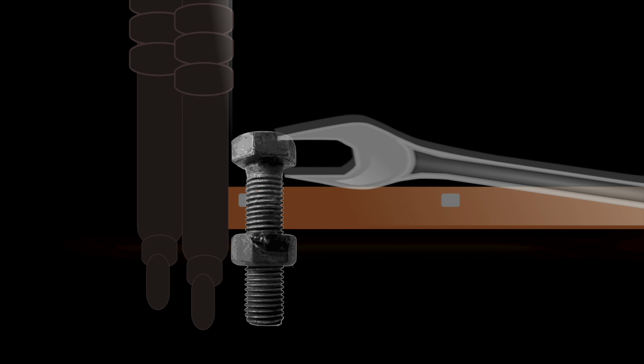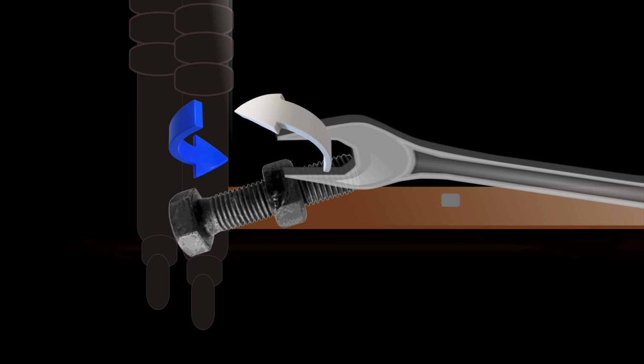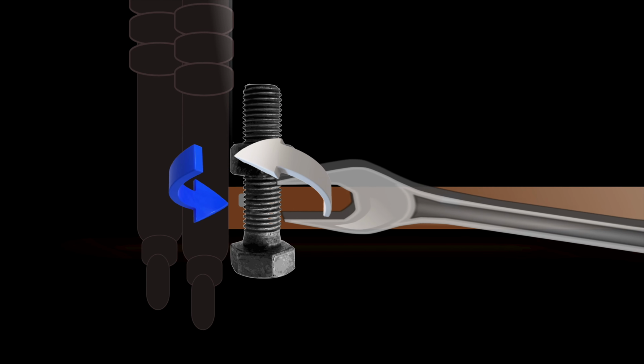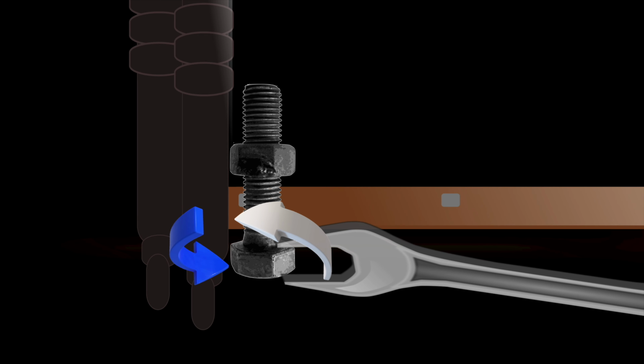So you get your wrench and rotate it in this direction to tighten the bolt. But suddenly you realize you screwed up. Welcome to the IKEA Self-Assembly Club. You realize the bolt is oriented the wrong way. It in fact needs to be inserted from the bottom. And as most of you have found out the hard way, now staring down at the bottom of this bolt, you cannot just rotate this the same way as before.